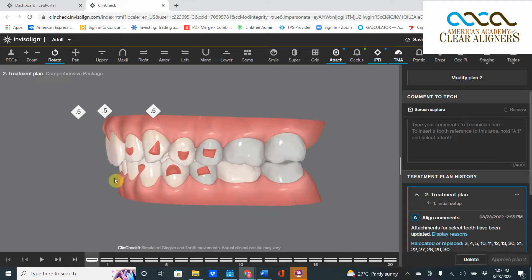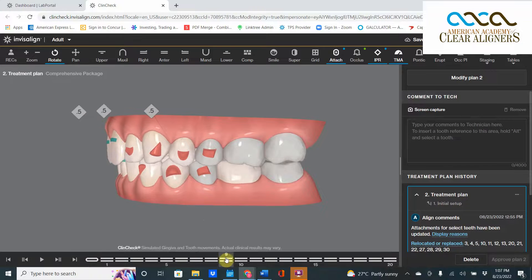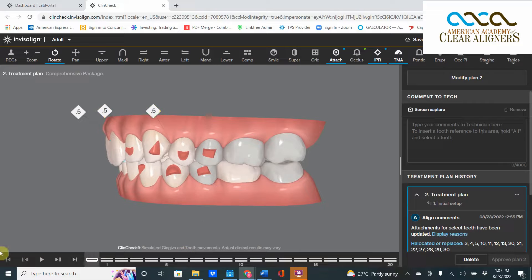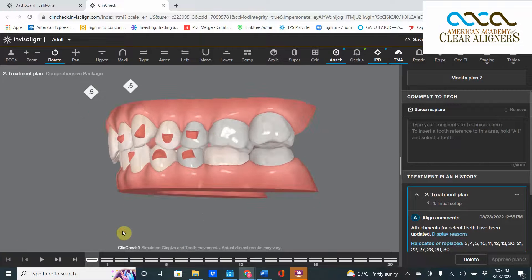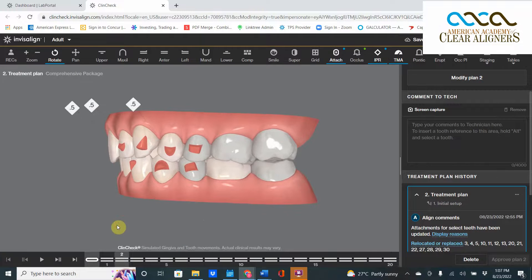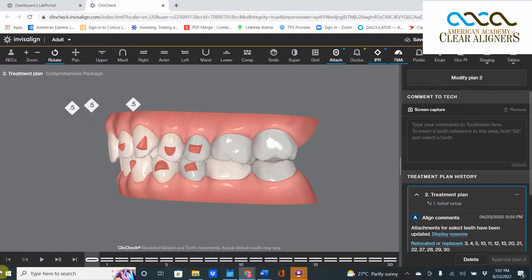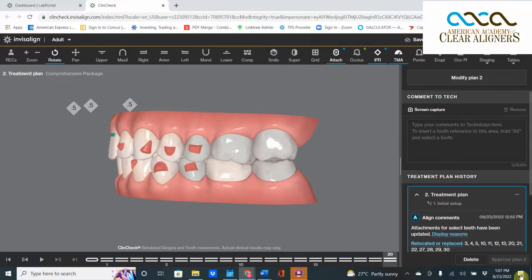Look at those two central incisors here. Watch this movement that they're doing. That's called lingual root torque, and I don't know why we're doing it. The teeth are straight up and down. If you go like that, they're going to pick up like this buck appearance and they're going to hit out the lower lip.